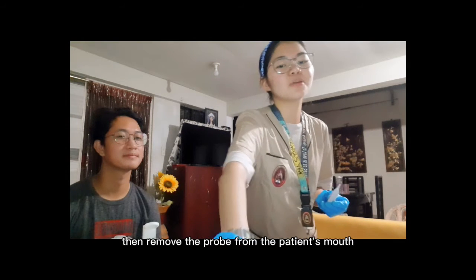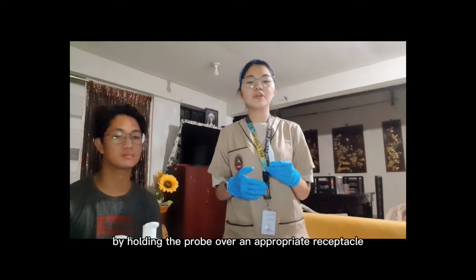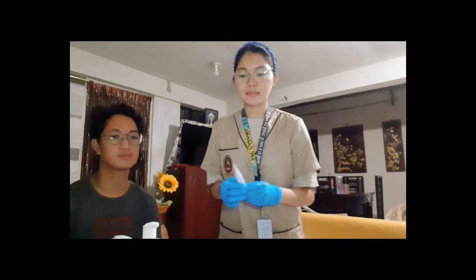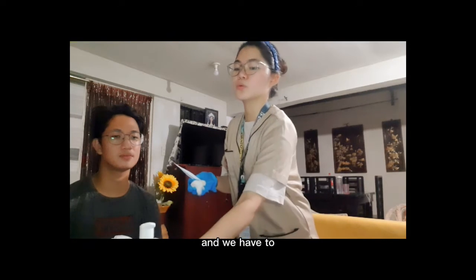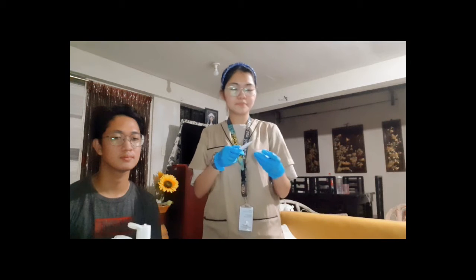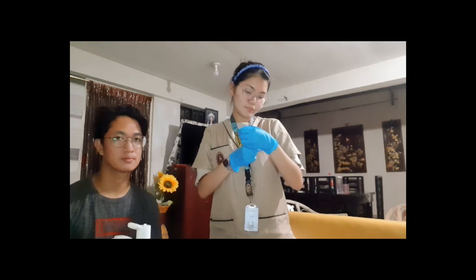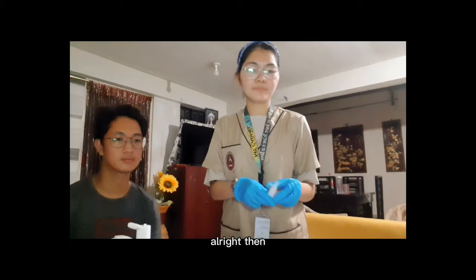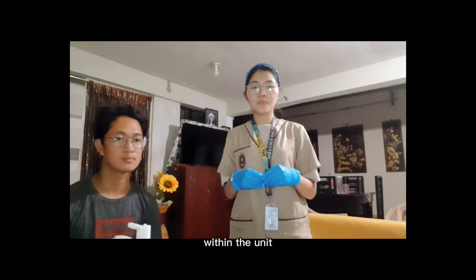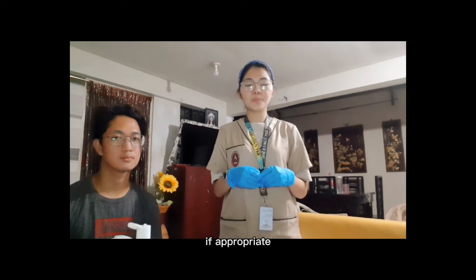Then remove the probe from the patient's mouth and dispose of the probe cover by holding the probe over an appropriate receptacle and pressing the probe release button. Then we have to disinfect the thermometer with the alcohol and cotton. Alright. Then return the thermometer probe to the storage place within the unit. We have to return the electronic unit to the charging unit if appropriate.